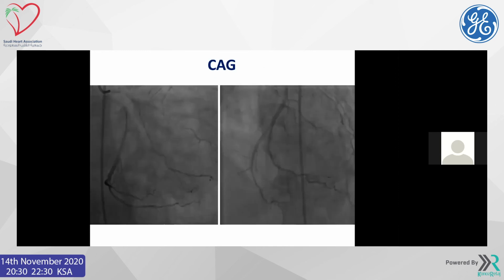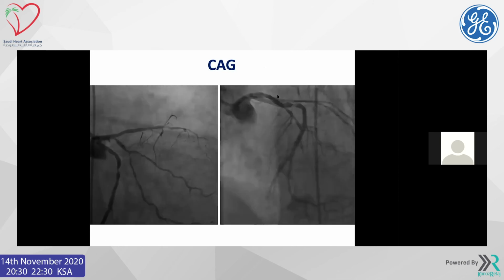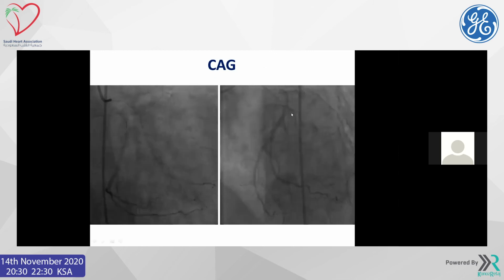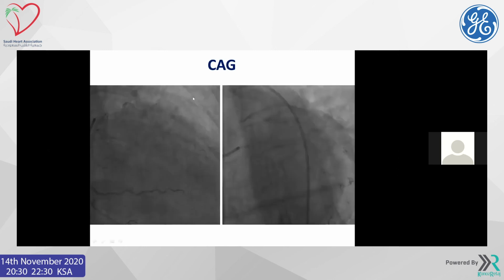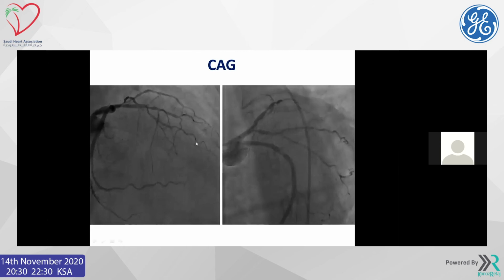These are some caudal views, and this is, sorry, the LAO cranial showing the mid LAD total occlusion. And here we can see the RAO cranial showing mid-total LAD occlusion. And this is the spider view.